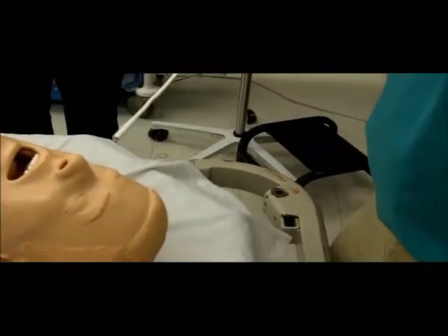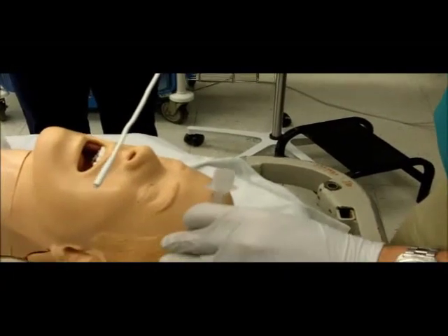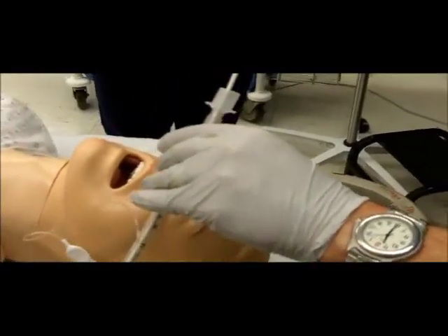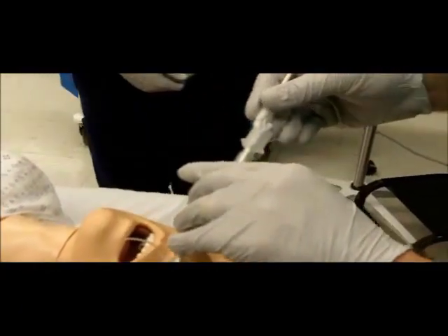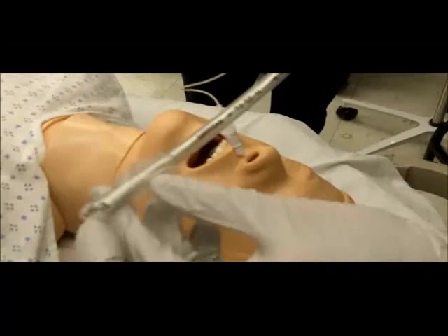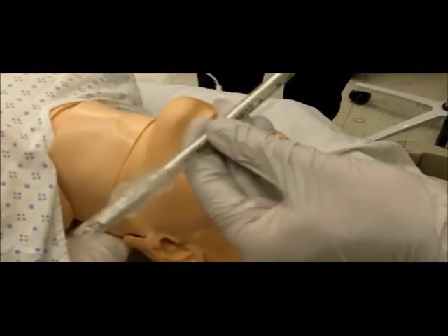Lubricate the rigid stylet of the wand and the endotracheal tube. Load the endotracheal tube onto the stylet. Insert the lighted stylet until the light source nearly reaches the tip of the endotracheal tube at or distal to the Murphy eye.